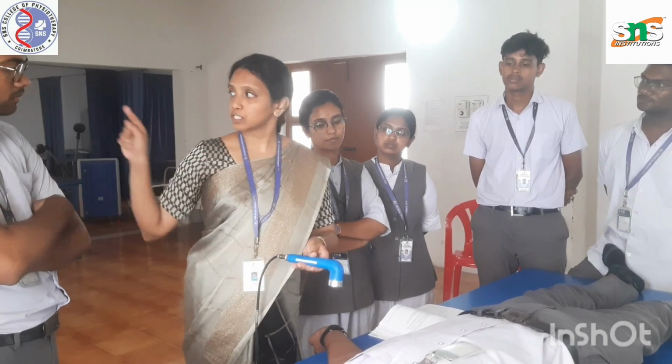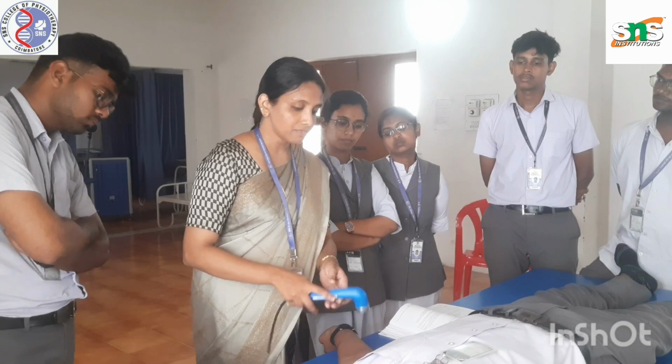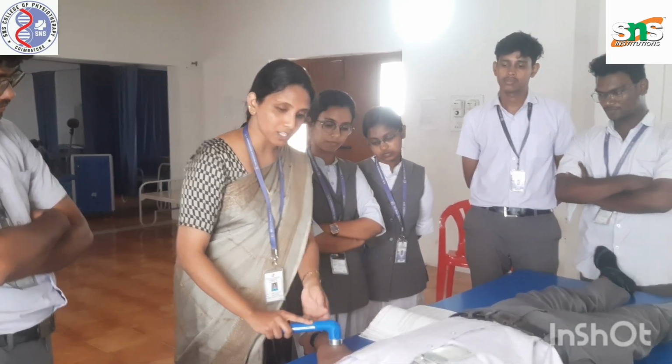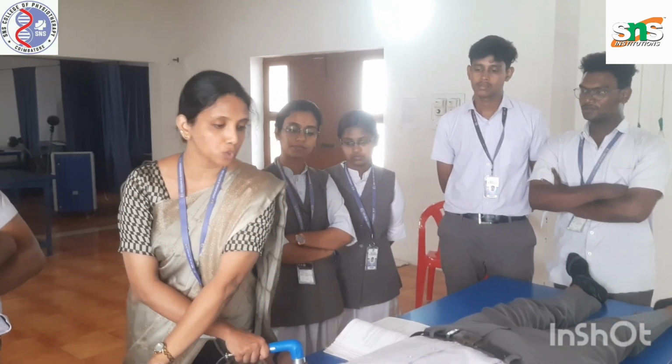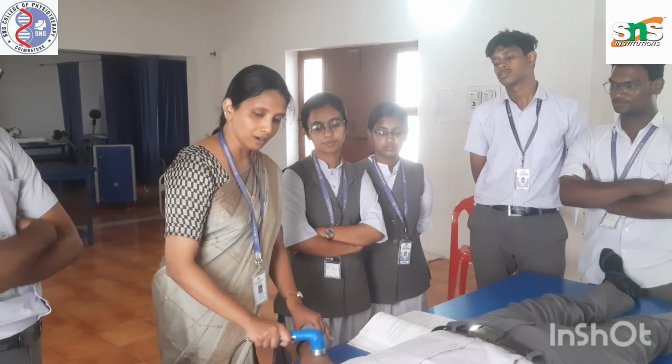So after the intensity is all set, you have to put a coupling media over the tissue, then you can place the transducer here. Once all is set for the treatment, only then you can switch on the machine. Then you can start your treatment.